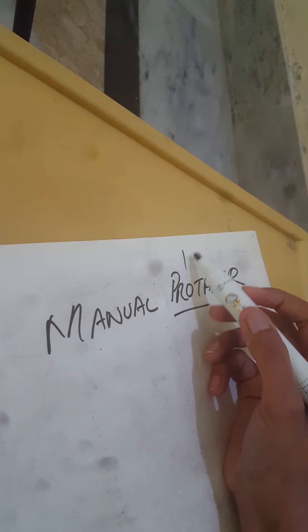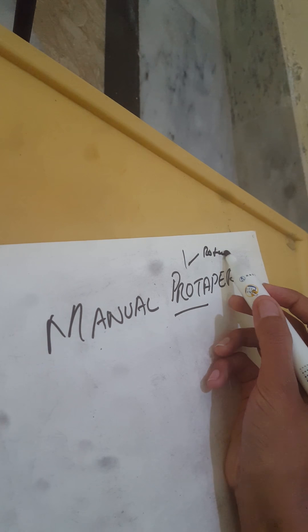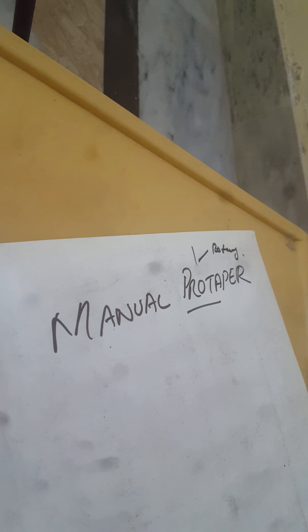In protaper we have two types: manual or rotary. Rotary is by means of the electric device, while the manual is run manually. We use the files and negotiate the canals and do their procedures.